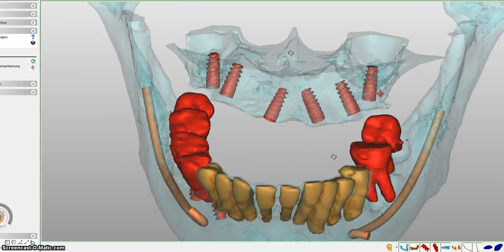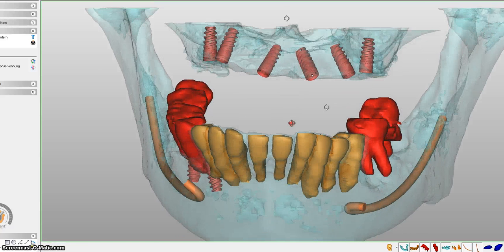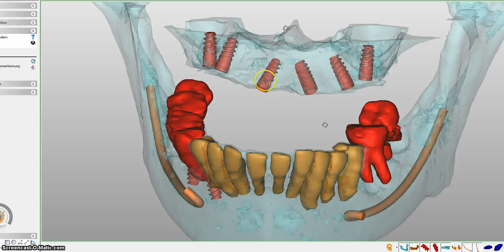And then we have to wait a certain time. Yeah? In the upper jaw, it's a bit longer than in the lower jaw. It's something between 4 to 6 months we have to wait, so the implants can heal in. Over that healing time, you will have a removable denture. It's a temporary removable denture. It's not a very comfortable time, but we have to wait because we cannot put any load on these implants before they have completely healed in. And the upper jaw is simply a little bit different than the lower jaw. It takes a longer time for the implants to make good contact with the bone so they are completely healed.